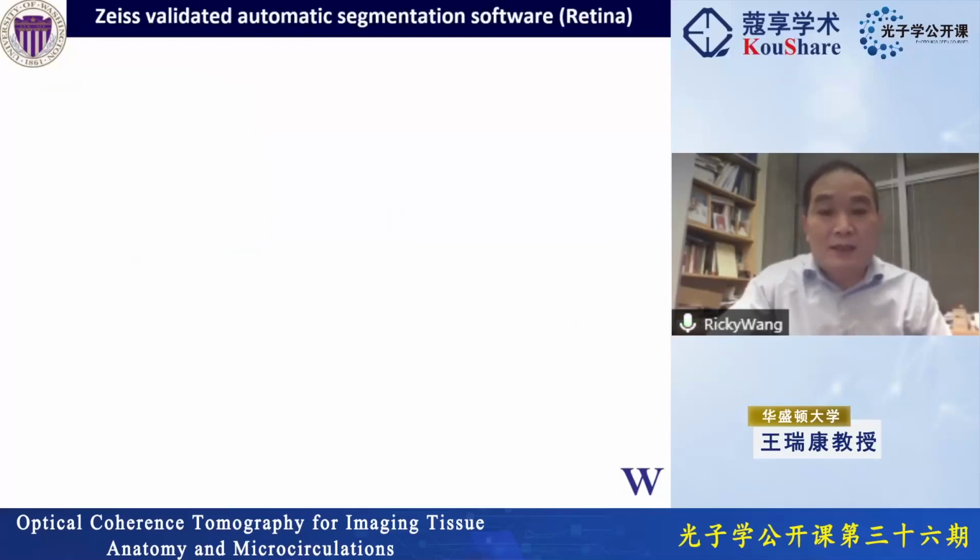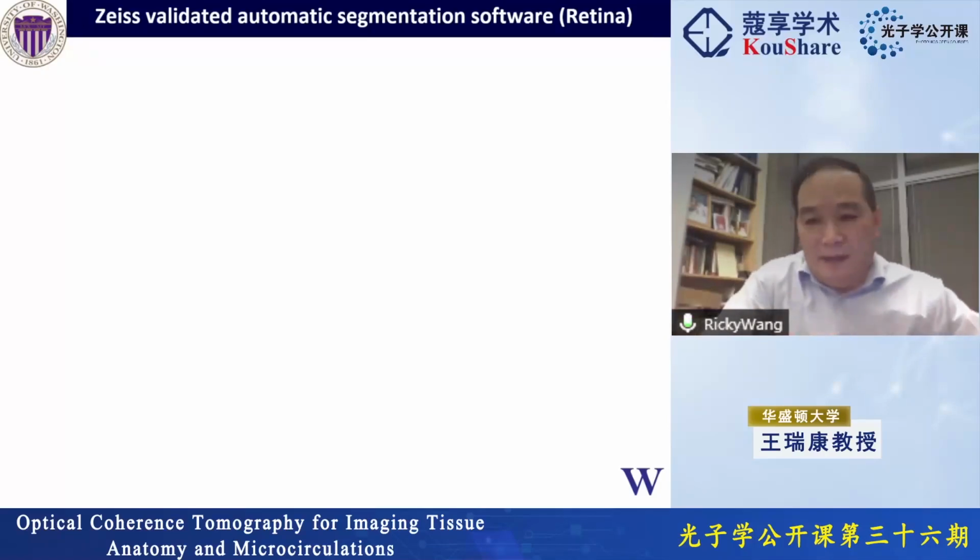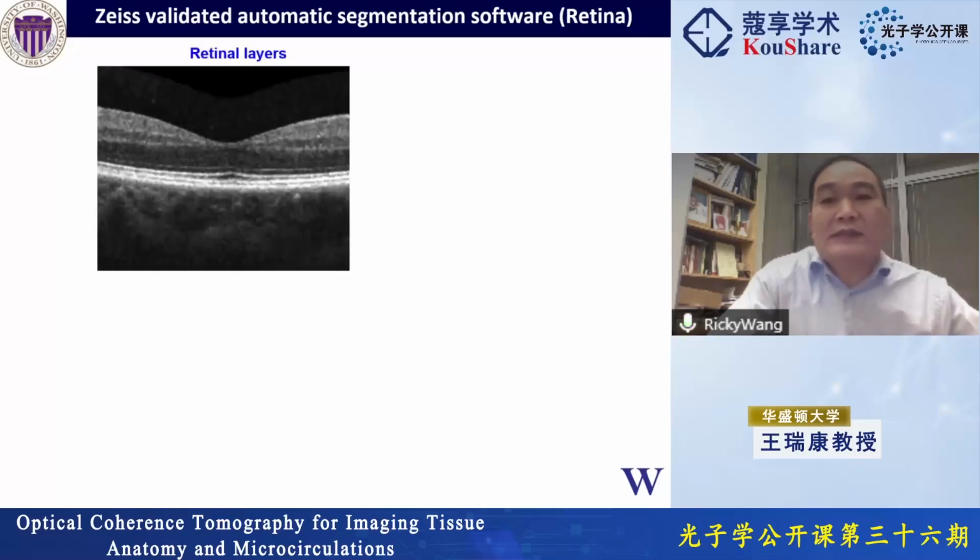Okay, and OCT is a 3D imaging technique. In talking about the structural imaging, it has a huge data size, and you have to reduce that 3D data into a simpler version of the images or results that can be presented to the clinicians for diagnosis. Okay, so in the commercial OCT system, of course it's important to reduce the data size, and that reduction of the data size in the 3D scans is called segmentation.